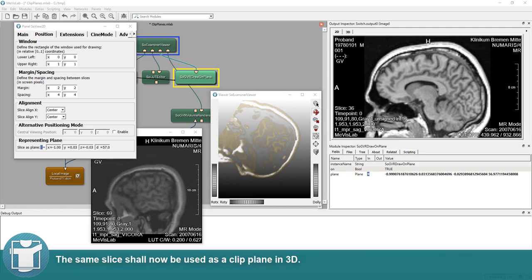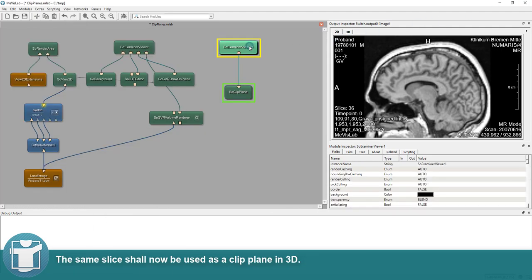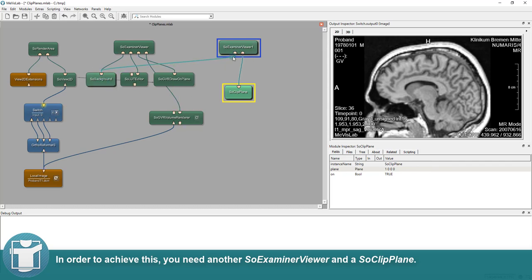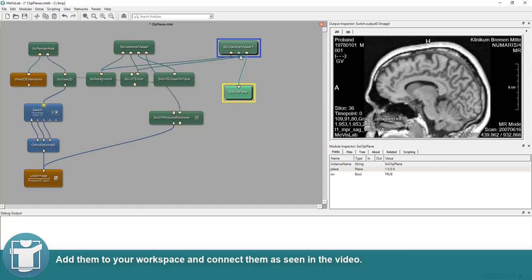The same slice shall now be used as a clip plane in 3D. In order to achieve this, you need another SO Examiner Viewer and a SO Clip Plane. Add them to your workspace and connect them as seen in the video.